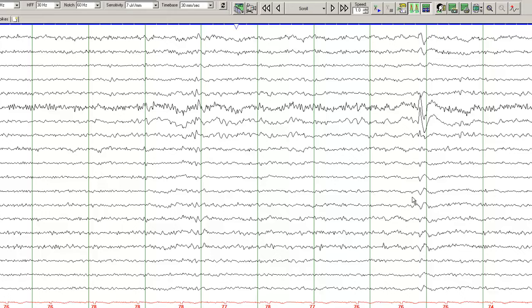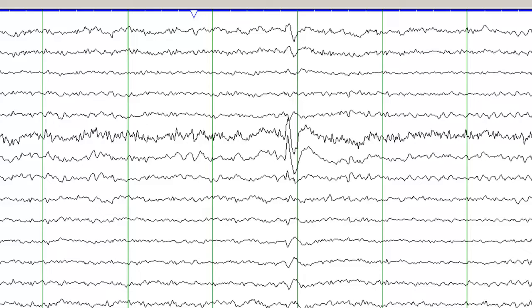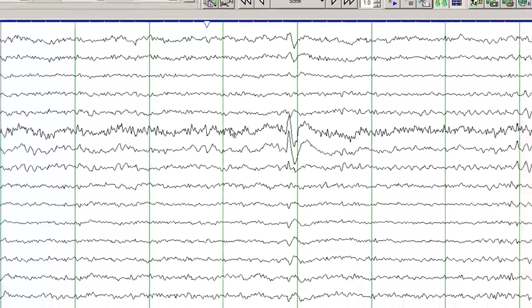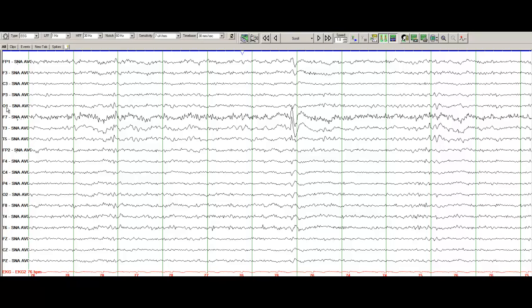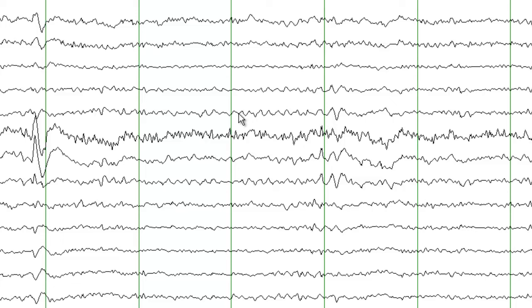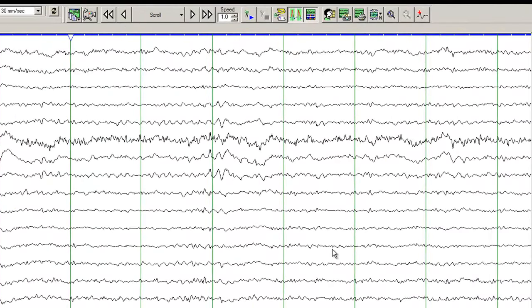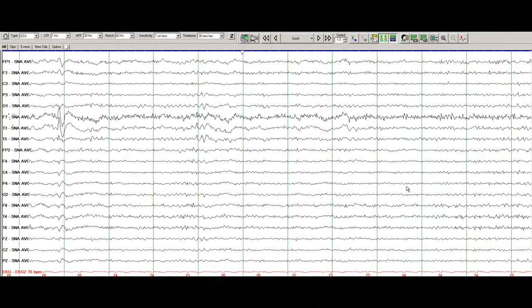So these sharp waves are quite clear — you are able to identify the sharp waves and the slowing. If you look at the posterior dominant rhythm — the rhythm you see in the occipital parietal head region — over this 2-second window you can count 1, 2, 3, 4, 5, 6, 7, 8, 9 Hz in O1, which is the left occipital head region. On O2 it is not as prominent, but it will likely become more obvious further along.